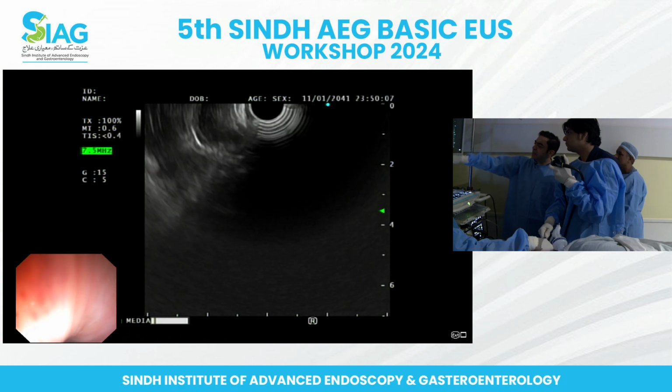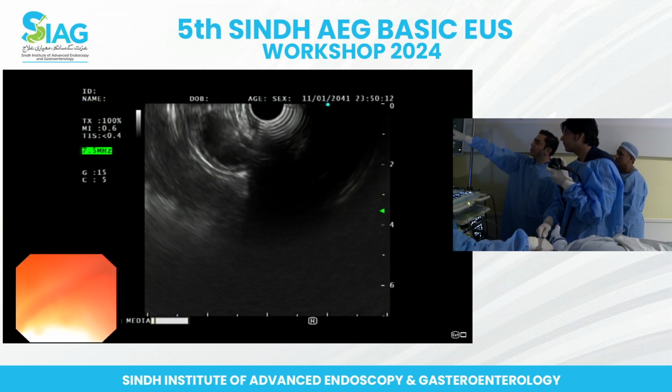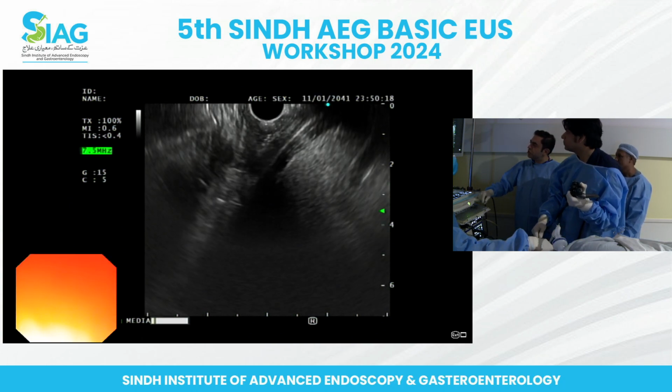Okay, so can you see that there was a bit of scope trauma there because of us? Yeah. So I think you're coming up with that lesion here. So now push the scope in slightly.